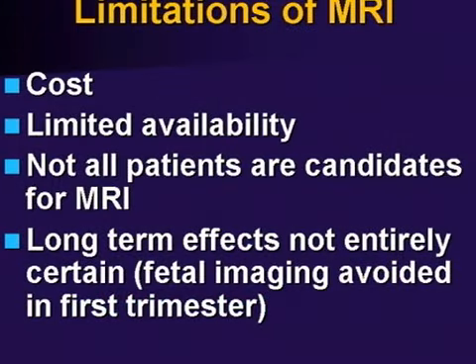Now, there are limitations of MR. It is costly. It's limited in availability in some places, and not all patients are candidates for MR. Patients are claustrophobic, patients have pacemakers. There are certain things that may not make the patient amenable to MR.